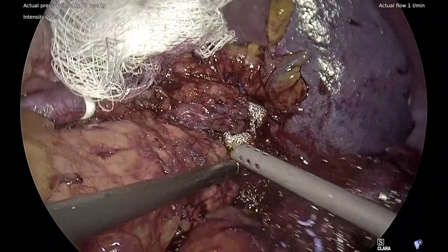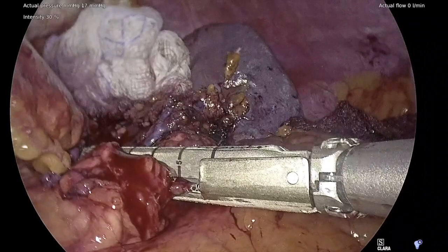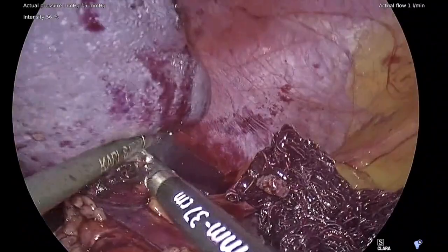Given the presence of ongoing hemorrhage, the decision was made to proceed with a splenectomy. The splenic artery was divided with a tan load of the stapler and then the pancreatic tail was transected using a black load of the stapler. After firing of the stapler, the staple lines were inspected for adequate hemostasis. The dissection was carried laterally to completely detach the pancreatic tail, and the suspensory ligaments of the spleen were divided with the bipolar shears.